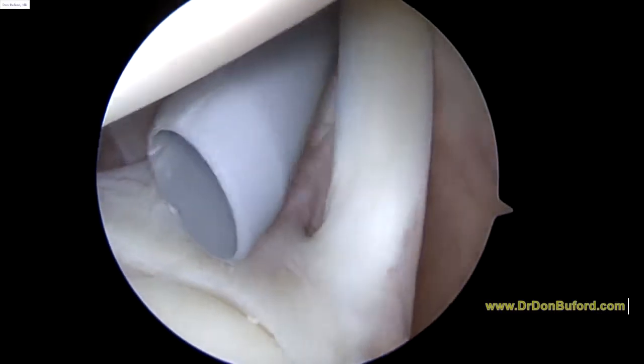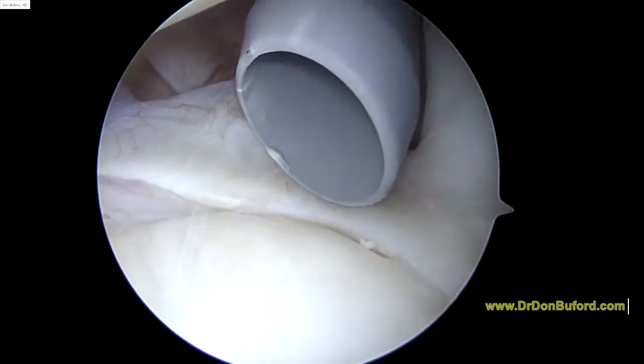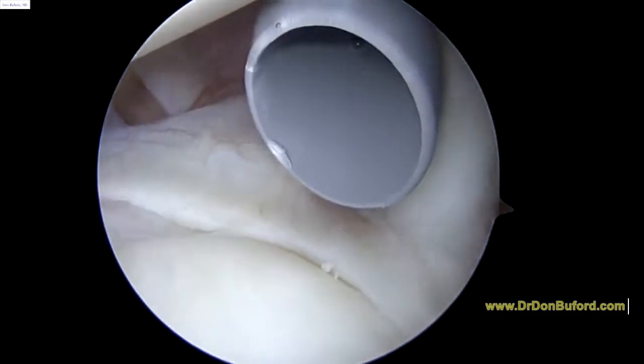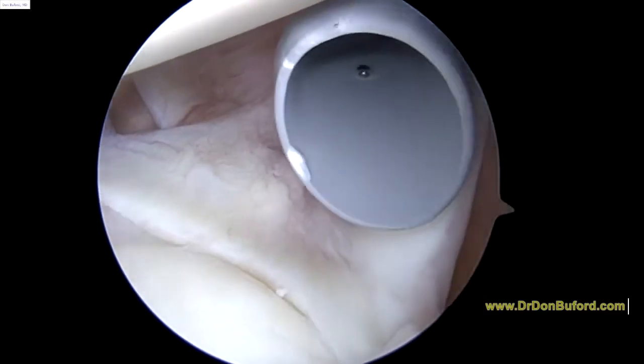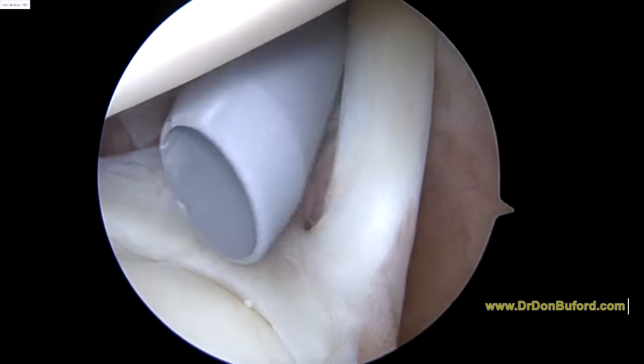Okay, it's Dr. Buford. We're just getting started on the left shoulder. We're looking in from the back to the front. Everything that you see is magnified 30 or 40 times on the screen. The gray cannula that you see coming in, just to give you an idea of the magnification, the opening in that gray cannula is about 5 to 5.5 millimeters, okay?